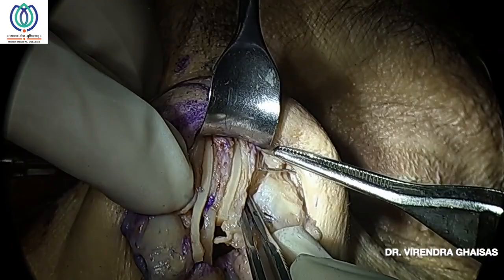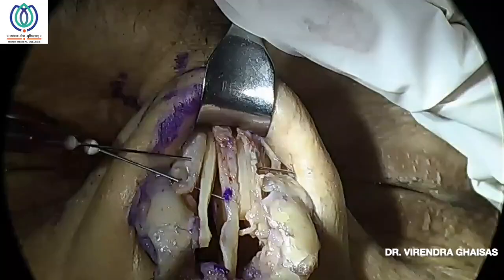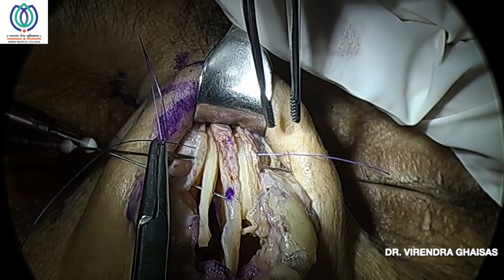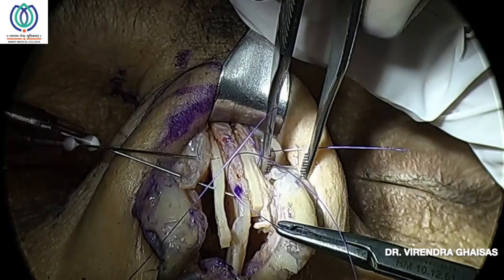If these grafts are longer than the anterior septal angle, then they are called extended spreader grafts. In that case, they have another function, lengthening of the nose. Then you suture it at the two sides with a 5-0 PDS to have better stability.